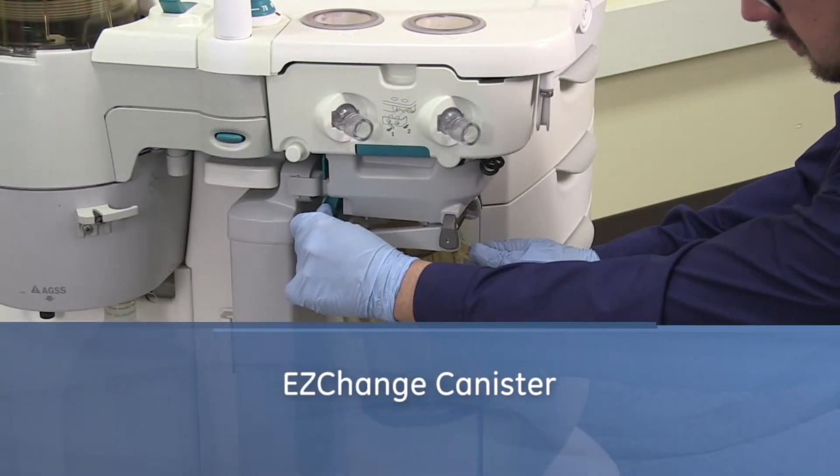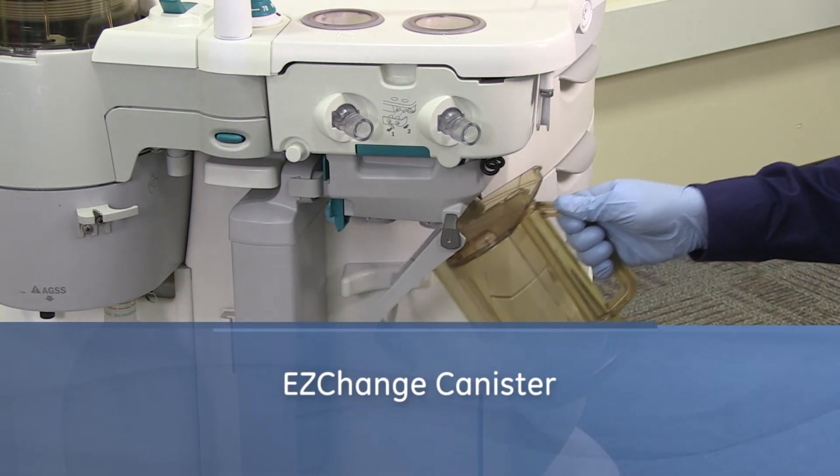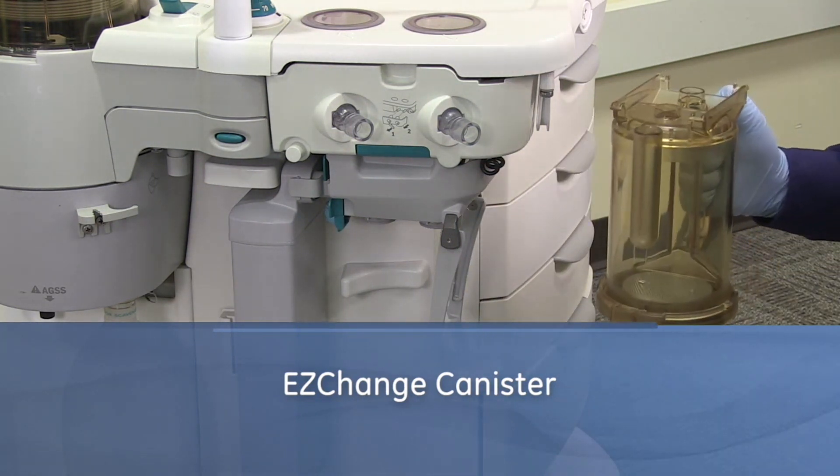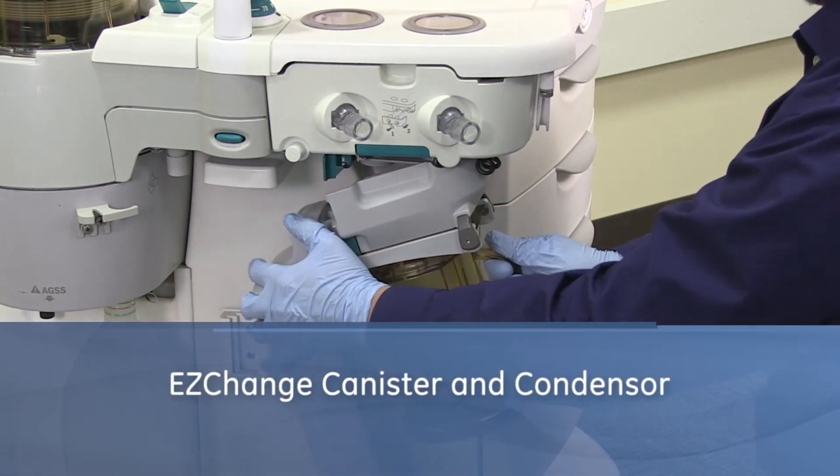Hold the canister by the handle and push the canister cradle release latch to unlock the canister cradle. Slide the canister up and out of the cradle. Push the module release latch and pull down on the unit to remove the module.